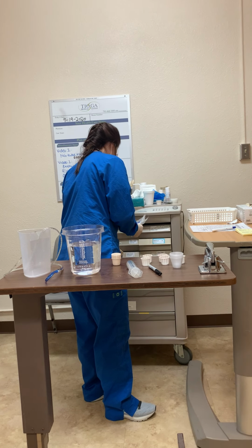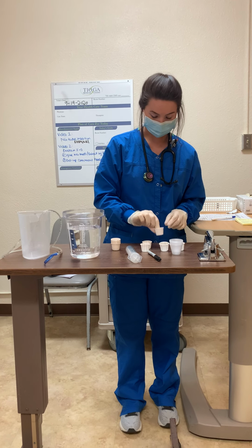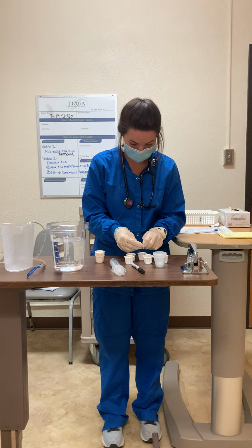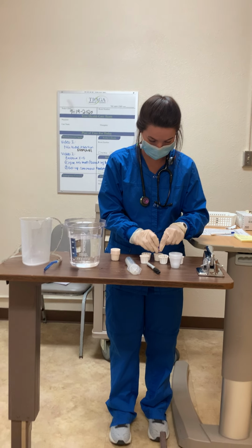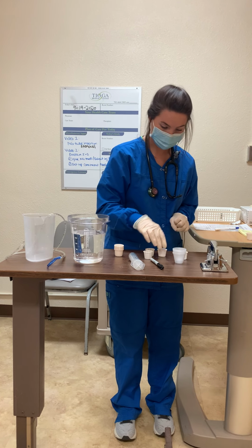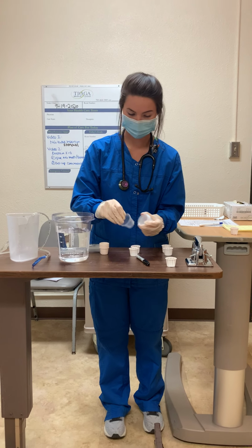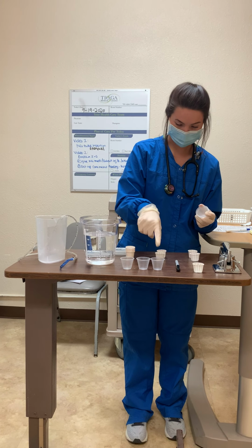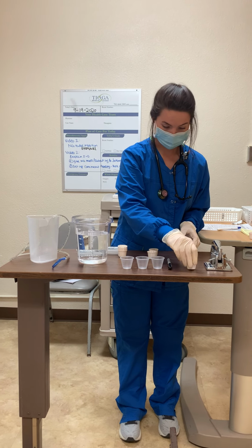So I'm going to put these back into my drawer. Each one of my cups, like I said, would be labeled. So this one here is my capsule. So we're just going to go ahead and open this one. Garbage. So you have that one here. And then on each one of these cups as well, so this is what I'm going to be mixing the liquid into, I would write on each one of these cups what medication I have in each cup and the milligrams. Okay, so this is the first one.